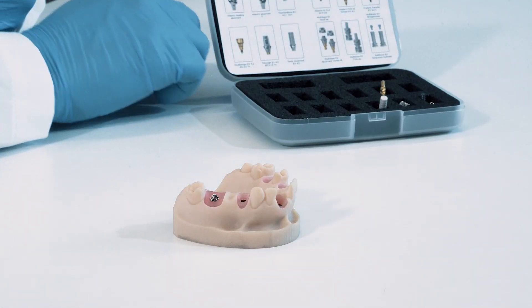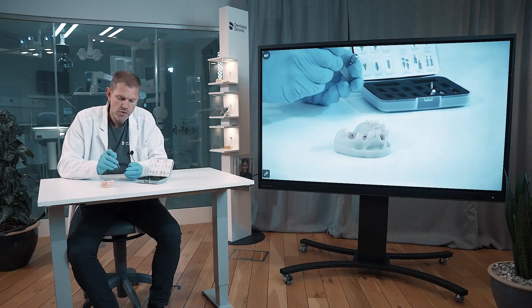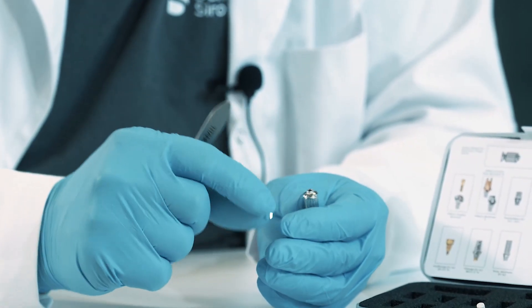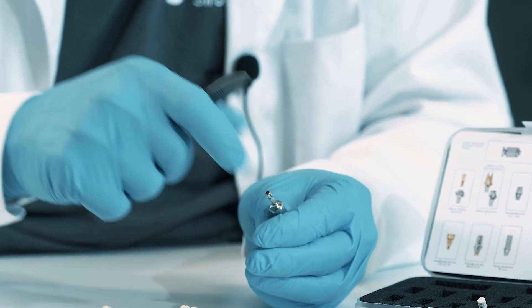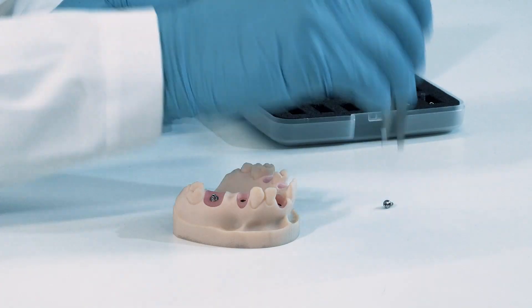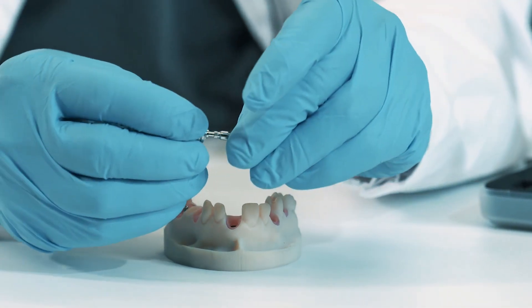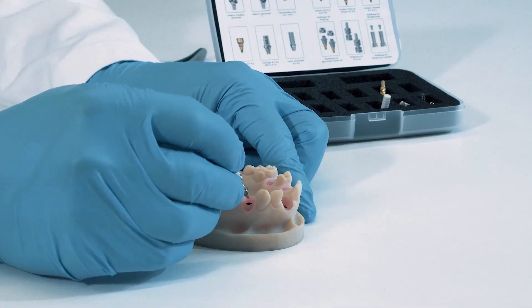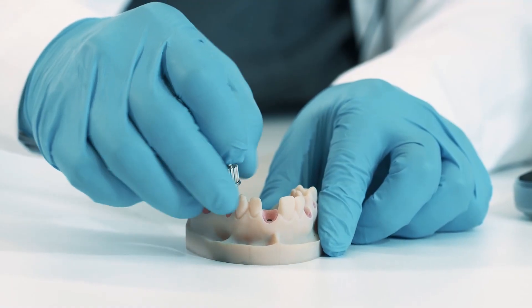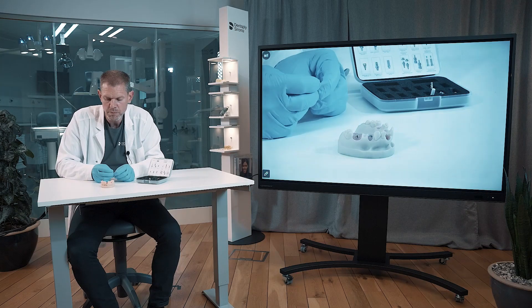For demonstration purposes, sometimes you don't have these plastic parts. Then you instead use the driver handle together with a multi-base driver. You take the second one, bring them together, and do exactly the same as you did for the first — tighten it down until it reaches the bottom, then take out the multi-base driver.